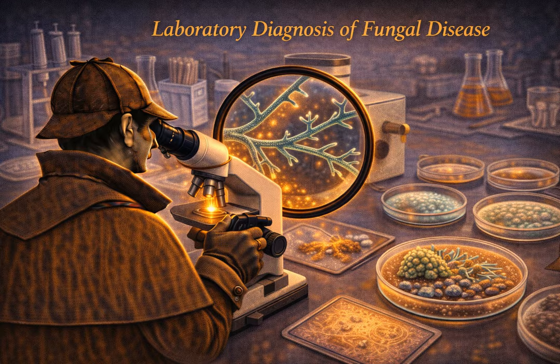What about the yeasts? If I have a creamy colony on a plate, how do I know if it's Candida albicans or just some environmental yeast? Yeasts are definitely harder to tell apart just by looking. Under the scope, they are mostly just little round or oval budding cells. But Candida albicans, which is the most common human pathogen, has a special trick, the germ tube test. This is a classic lab test. How does it actually work? It's incredibly simple and elegant.